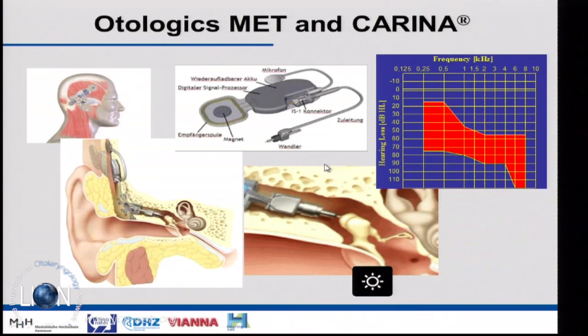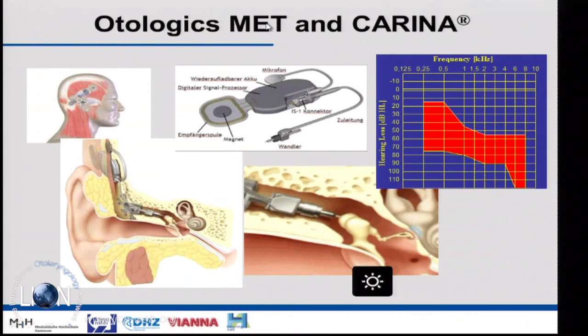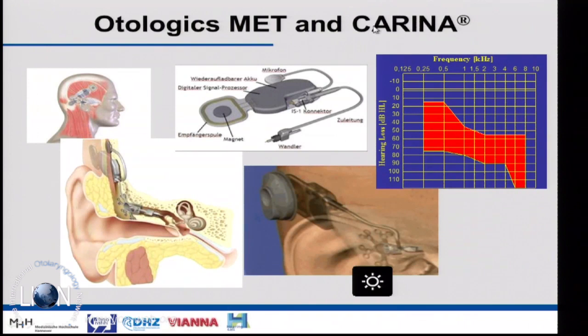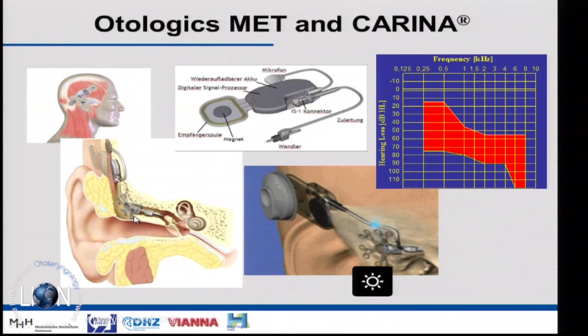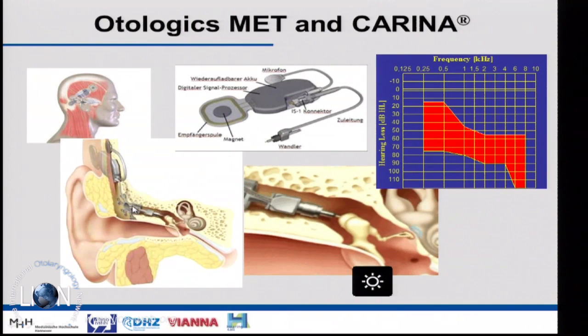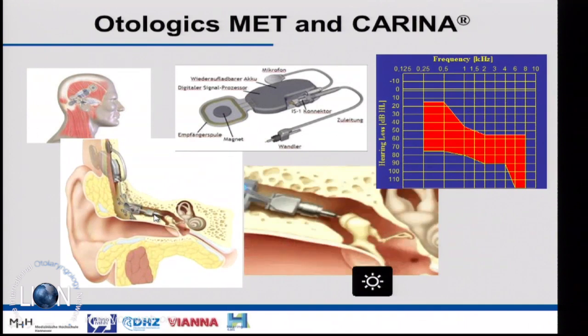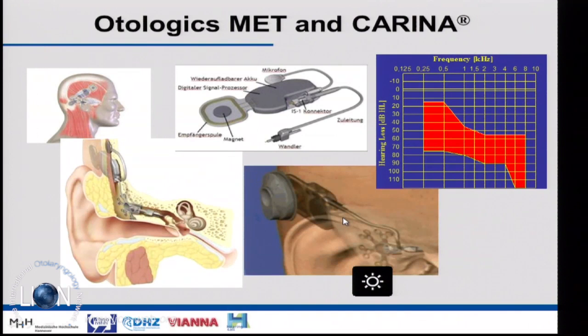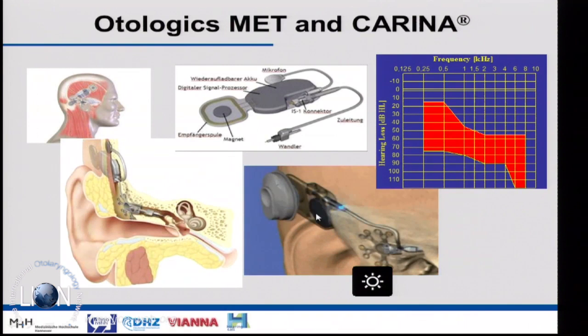2 points of fixation. And one is in the field of otolaryngology, the middle ear transducer, and the fully implantable version called the Carina. Now what they do is actually to use 1 point of fixation at the rim of the mastoid, as you can see here with this plating system. There is a transducer, and the transducer itself goes then onto, for instance, the incus head or any other place on the ossicular chain, and transmits the sound directly to the chain.